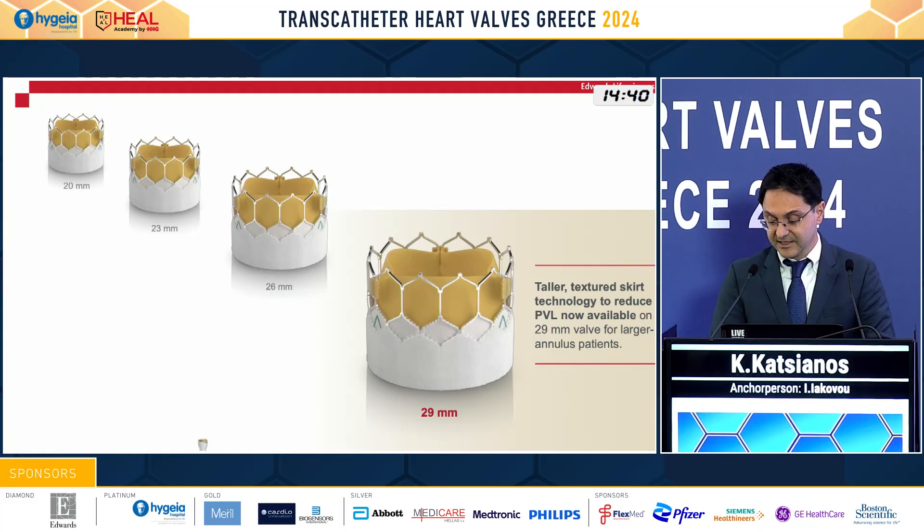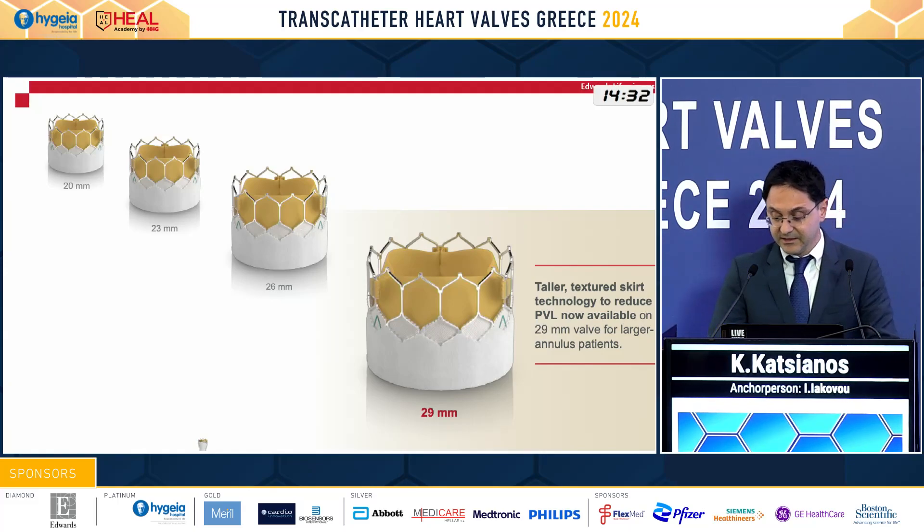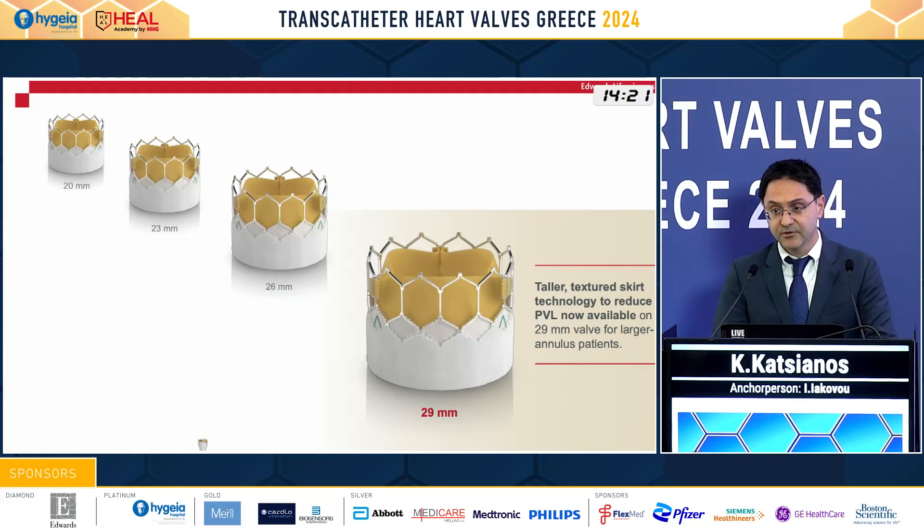Also innovative is that at the bigger dimensions, the 29 millimeters, we have the Ultra technology, also a skirt, that we also took advantage of, and we will see in our next patient that we are going to present.